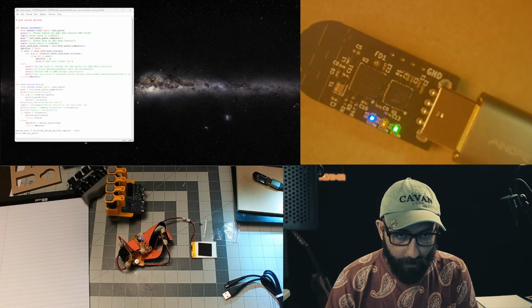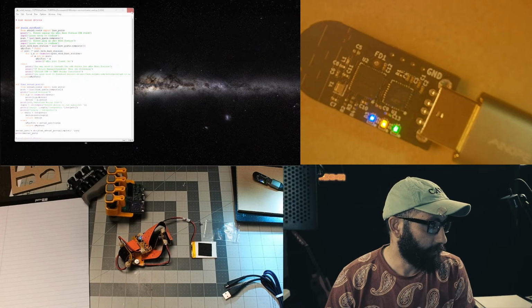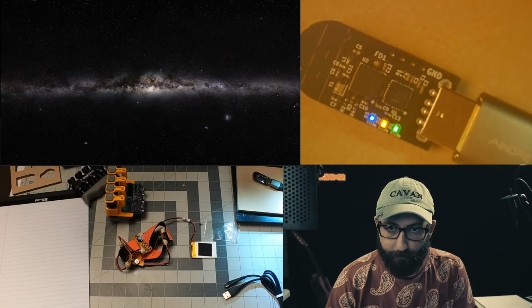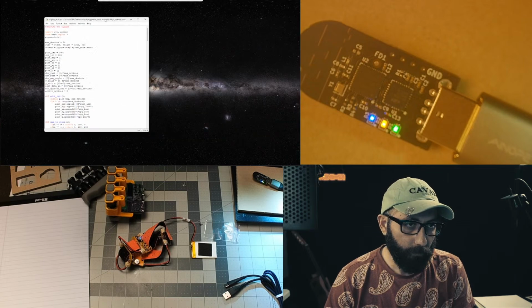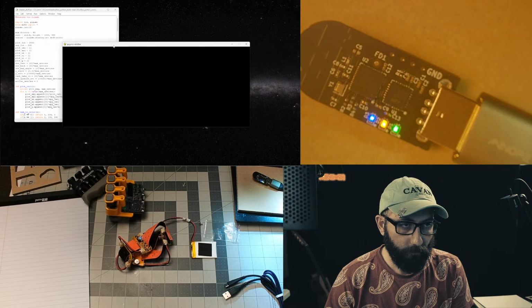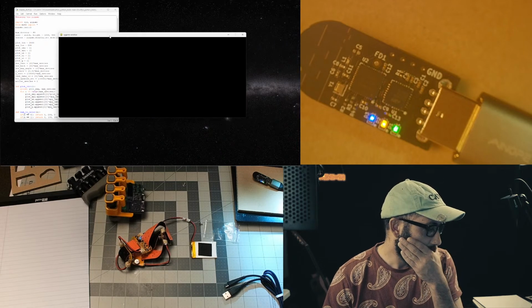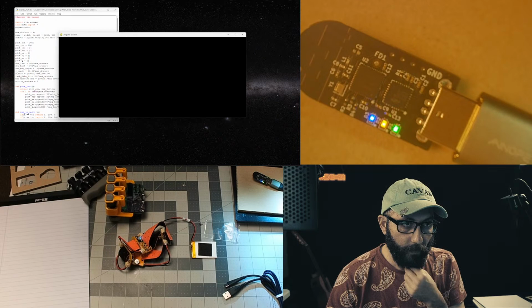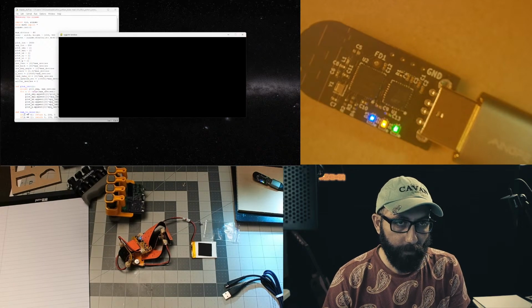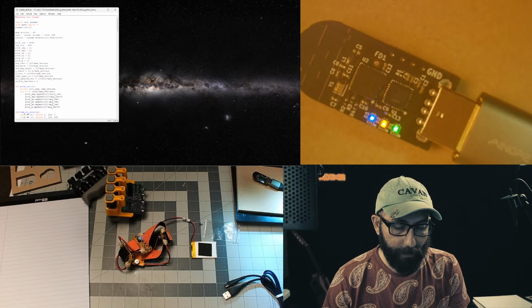And we'll see what this is. I think this one is just display stuff. So we're going to close this, open with Python. We're just kicking the tires here. And so it exited out, which is just fine, because I think you have to do it in a couple of methods, which is just fine.